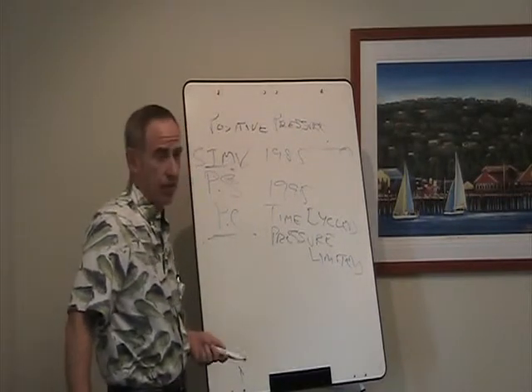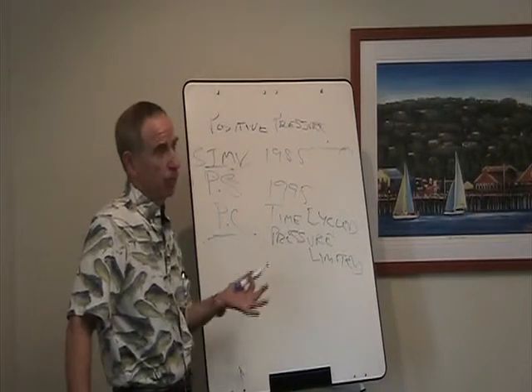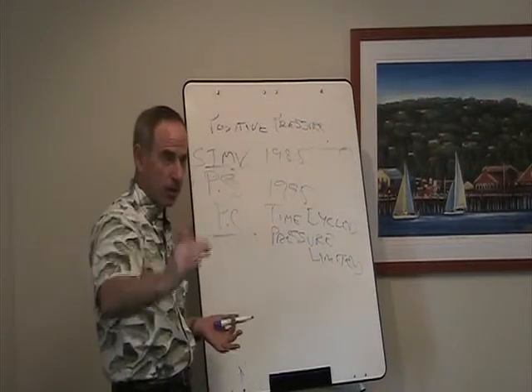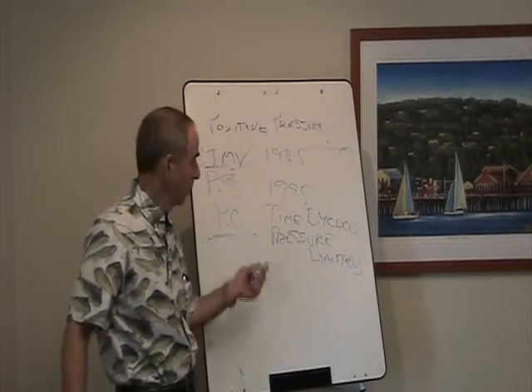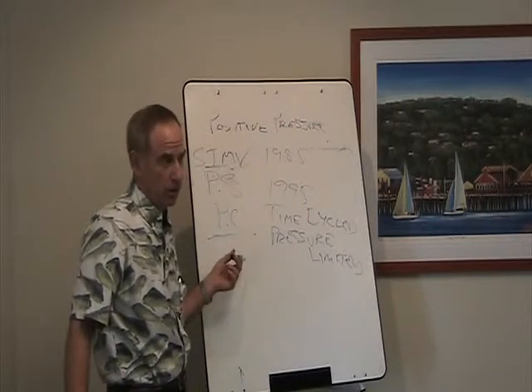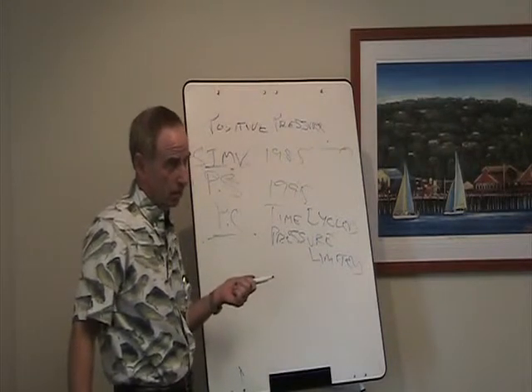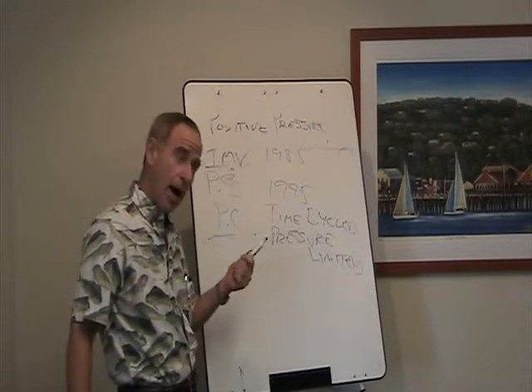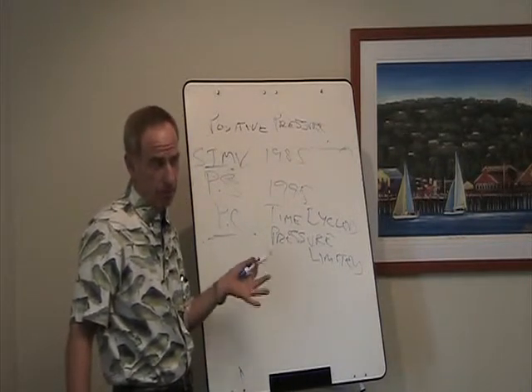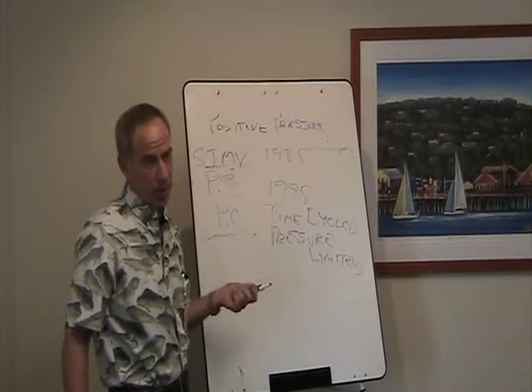But what cycles the ventilator? Instead of the patient's flow rates cycling the ventilator, the inspiratory flow rate, remember I said it cuts off after it gets down to 25% of the initial flow rate with pressure support. With pressure control, it's really a time cycle mode of ventilation. So you set the time that you want inspiration to be. Or you can set the IE ratio, and it'll basically calculate the time for you based on the rate that you've set.